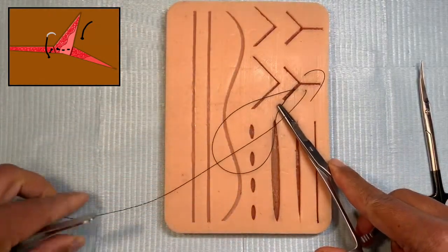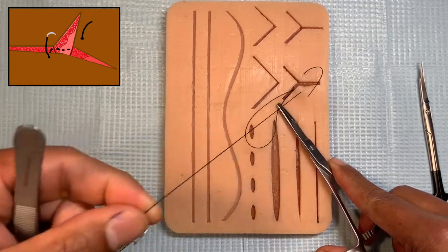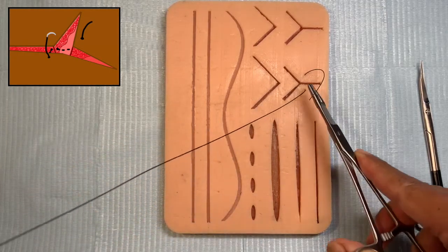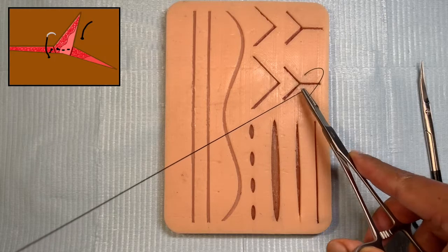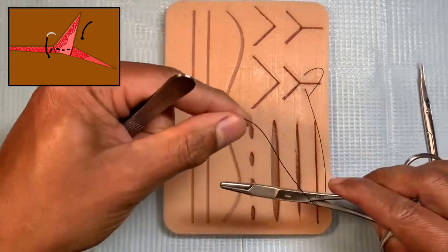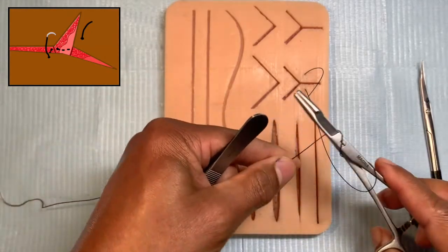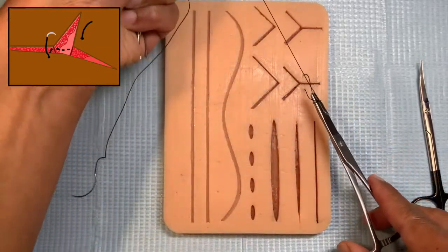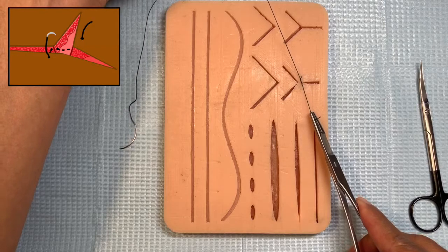So now you can see that the three bites have been taken: one is taken through the skin, one is through the papillary dermis, and the other one again through the skin. When you tie this, you use a 2-1-2 configuration—two forward, bring it across the wound.